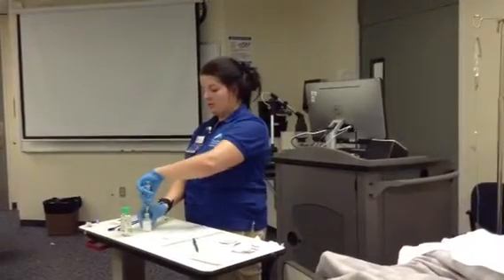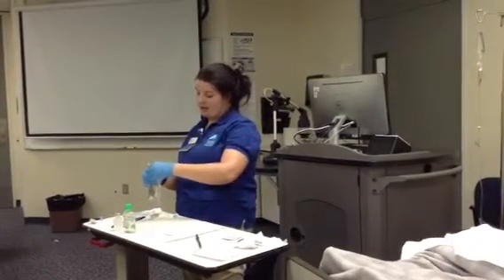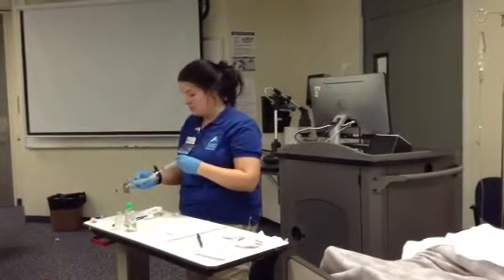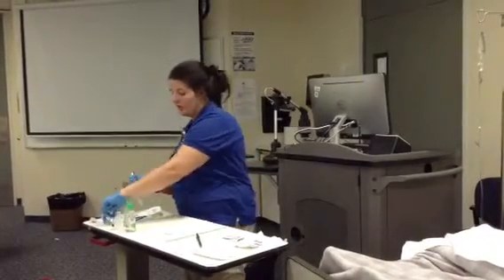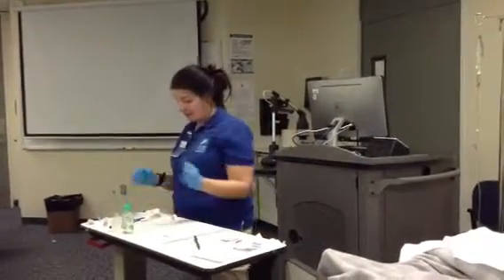Perfect. Okay. Alright, go ahead and administer my medication into the bag. Alright, perfect. Okay, this would go into the sharps, and I would gently mix my medications. Everything's mixed and ready to go.